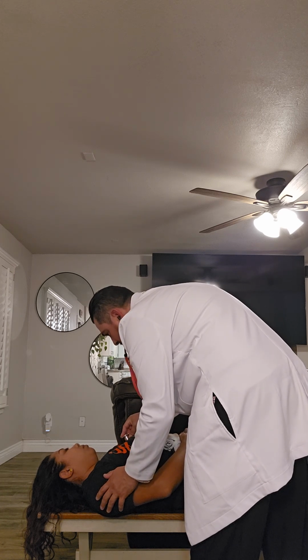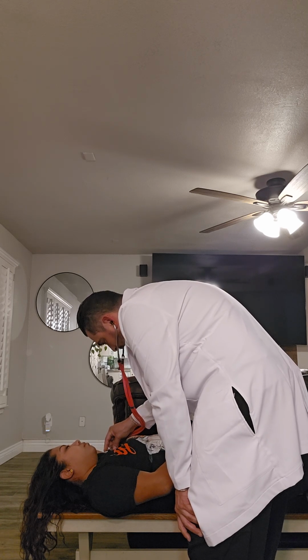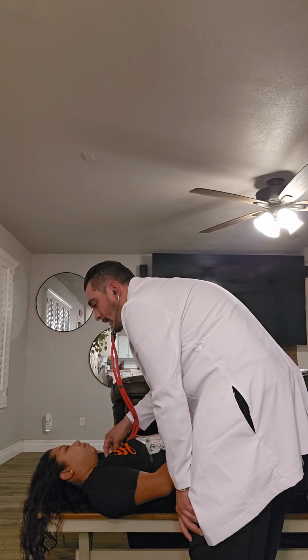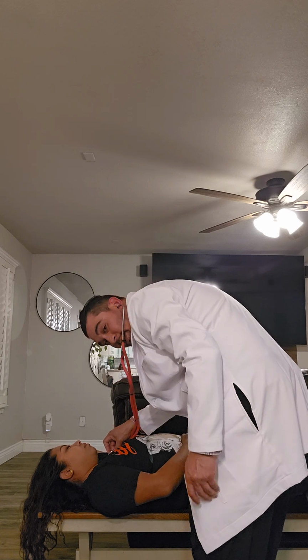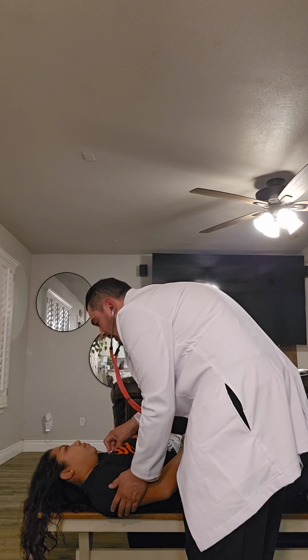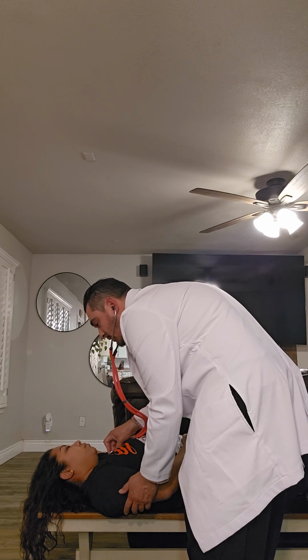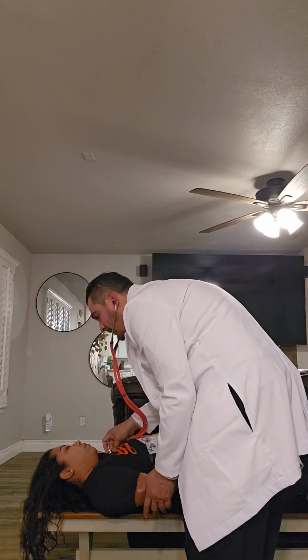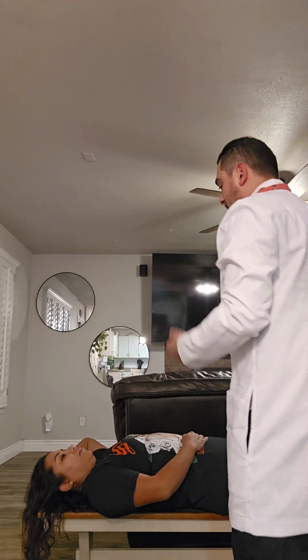Again, moving up. And then right here at the base, I'll ask her again to take another deep breath. Go ahead and take a deep breath for me. Hold it. And at this point, this is where I would be hearing the splitting sound, this one. And I could hear it. So at this point, I'll ask the patient to sit right back up.